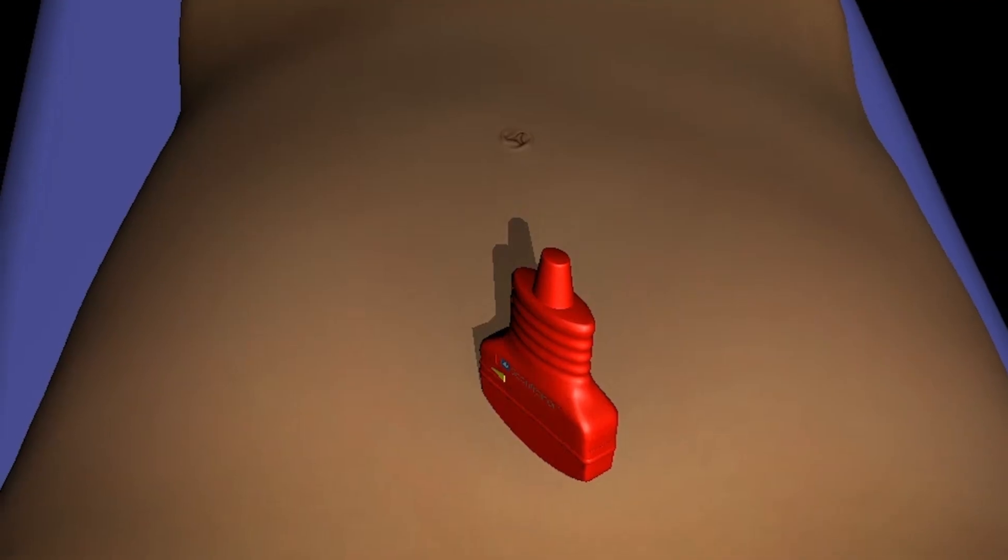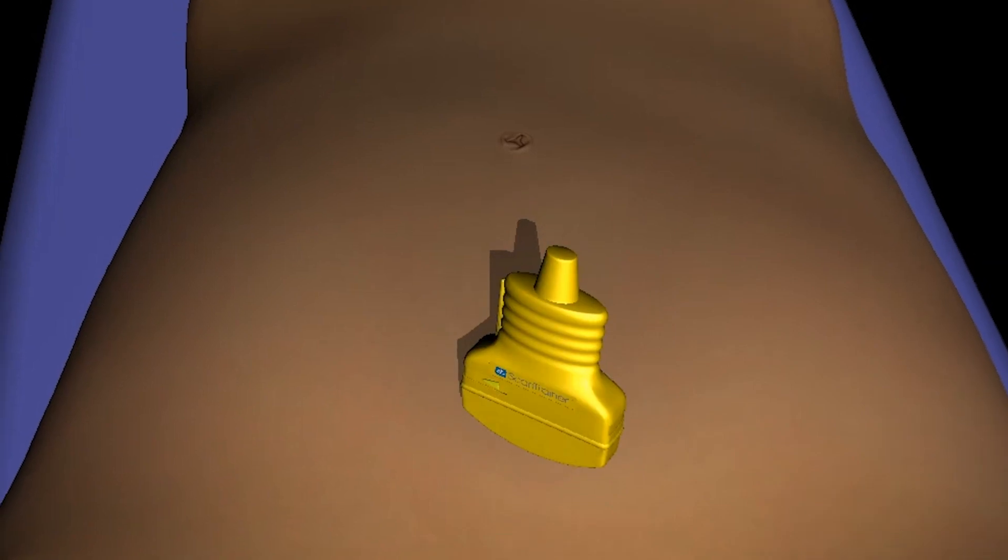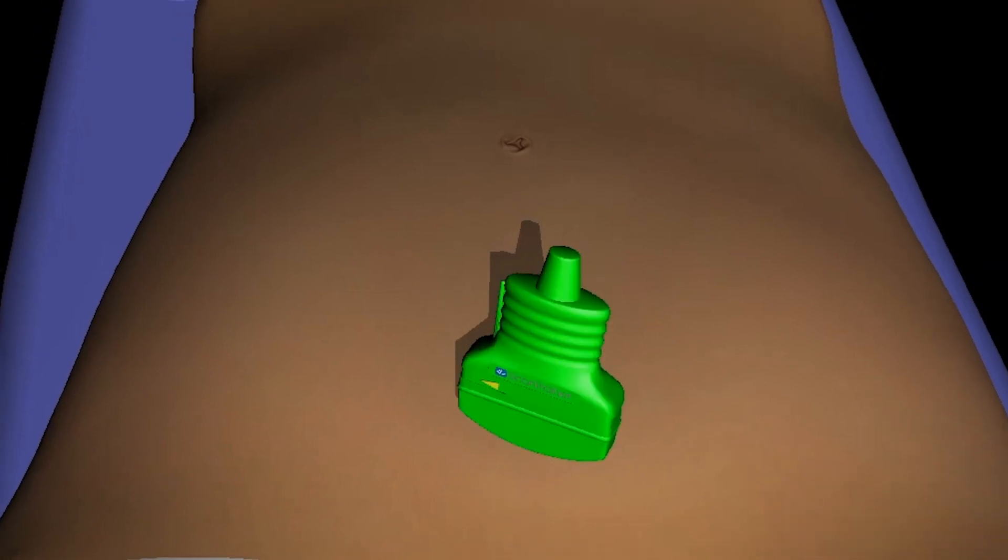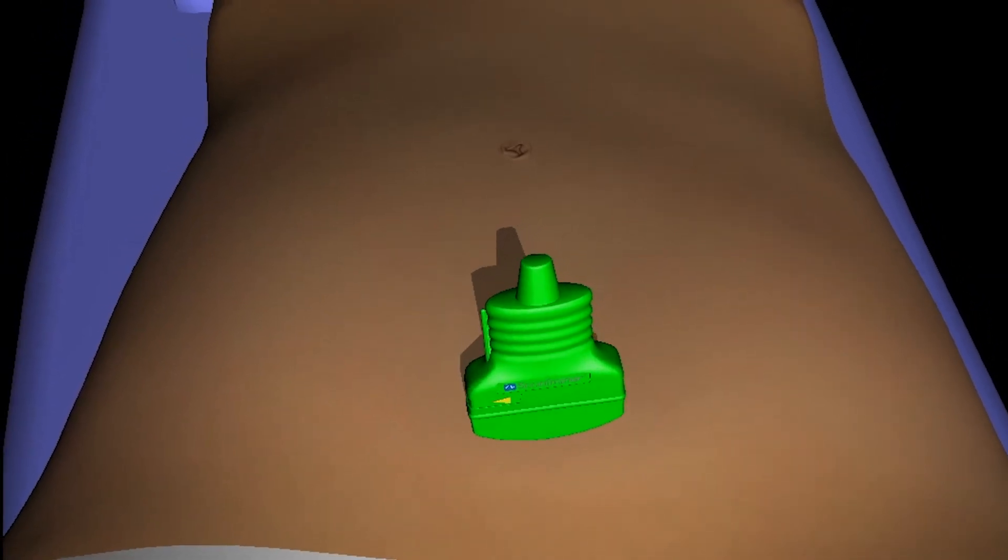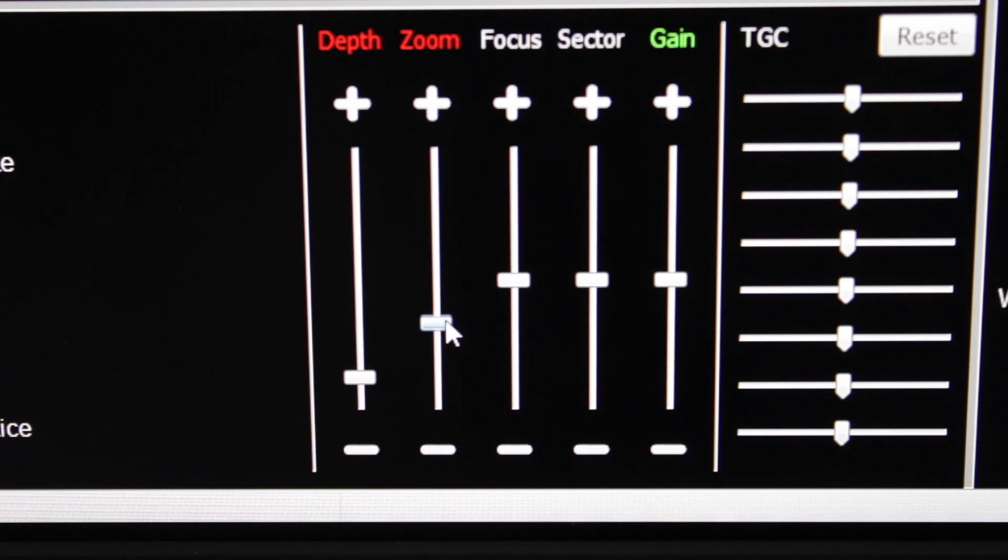Providing real-time expert guidance while scanning, traffic light indicators highlight when the probe is in the correct plane and when the image is fully optimized.